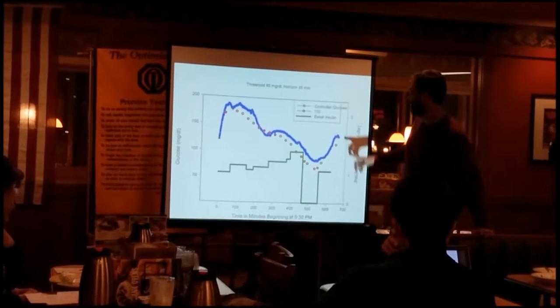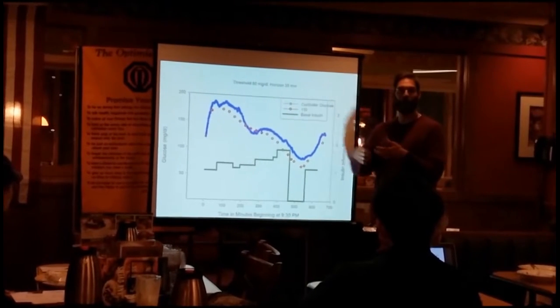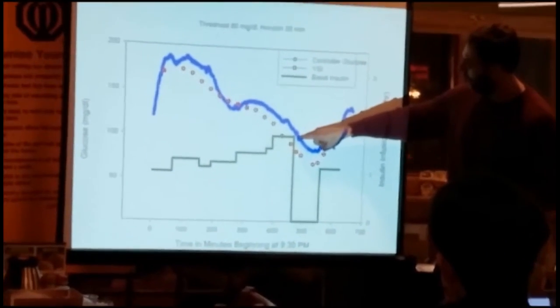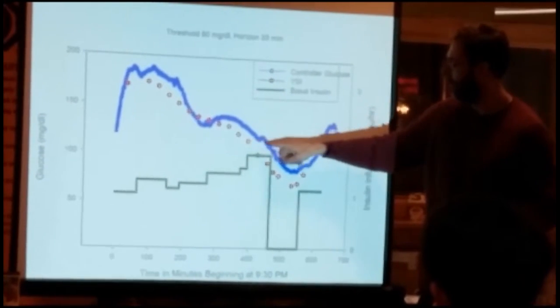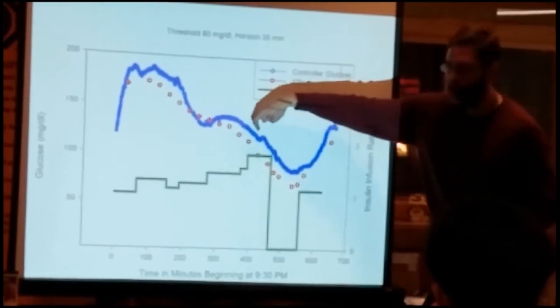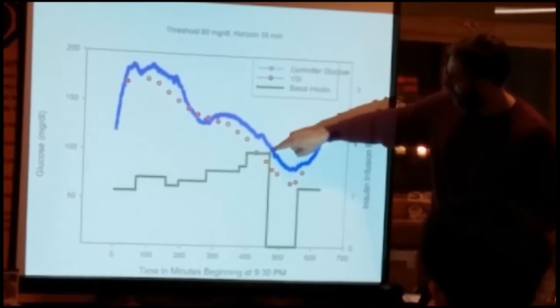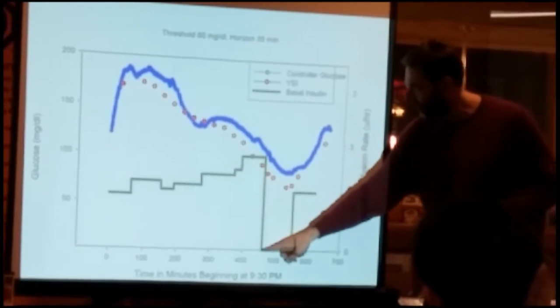That's great. So how does this system work that's a little bit different? This predicted low glucose suspend as opposed to the wait till you're low and then suspend the insulin? So the way this works is as this glucose started going down, this is the sugar measured 2 different ways with the red dots and the blue line. The green is how much insulin was going in. So we work with some really smart engineers who are able to do the math on this. And they've got the algorithm where they said, okay, when it got to here, it's going to go down below 80 in 30 minutes. So we're going to stop giving any insulin.